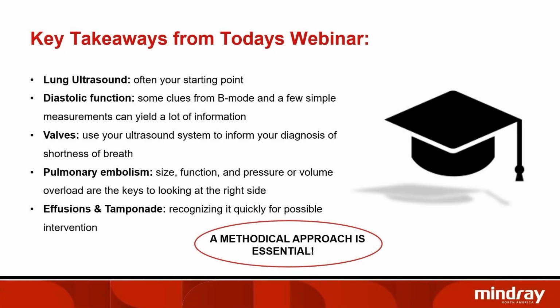Thank you for joining us for today's webinar. There was a lot discussed today, so the most important key takeaway is that a methodical approach to your cardiac scanning is essential. Evaluating dyspnea can include lung ultrasound, the evaluation of diastolic function, the interrogation of valves, the detection of pulmonary embolism, and the detection and treatment of effusions and tamponade.